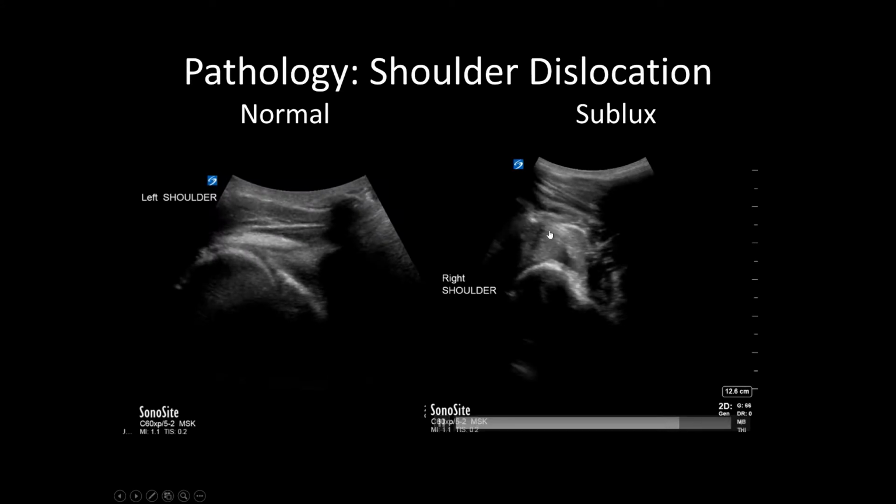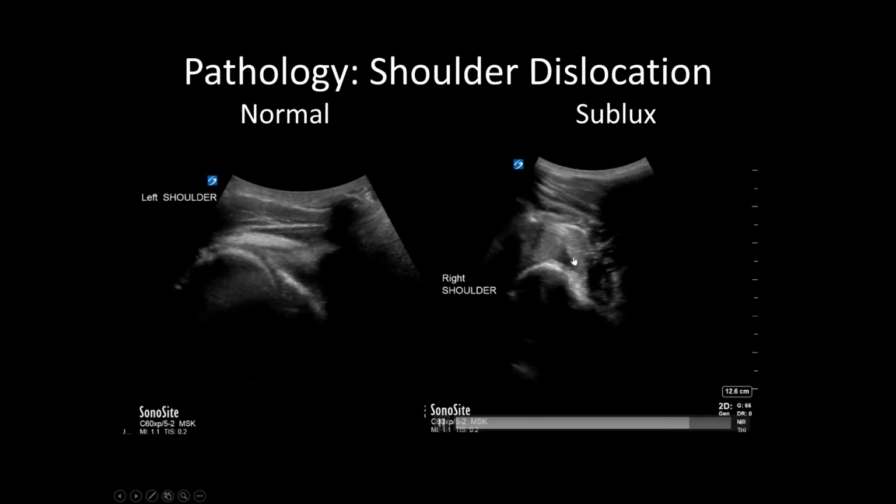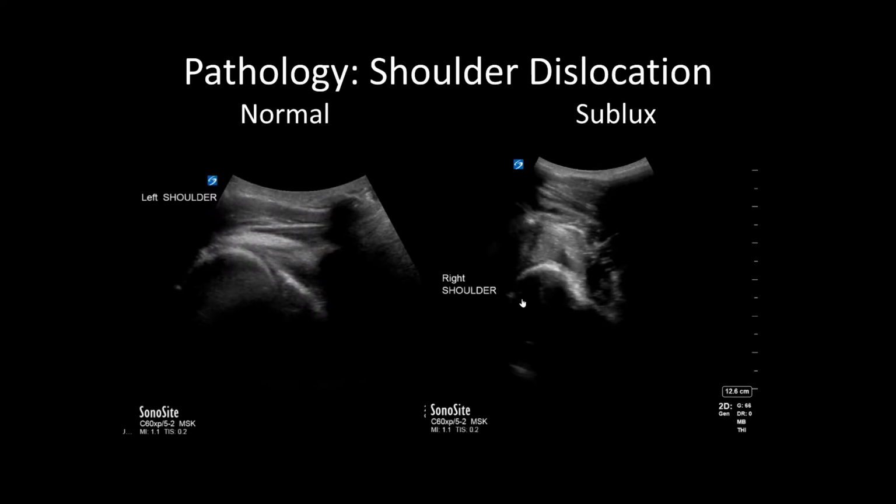In a shoulder subluxation, the scapula will again appear triangular. However, you'll notice here that the glenoid fossa is empty as the humeral head has dislocated inferior and anterior. This is placed in the same position, leading edge facing lateral in the posterior aspect of the right shoulder.